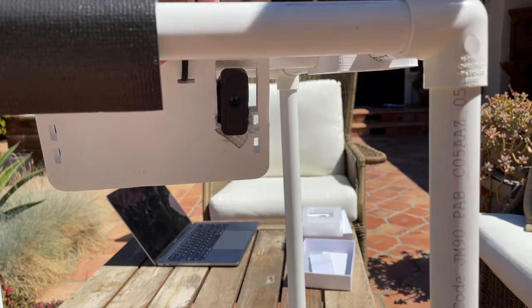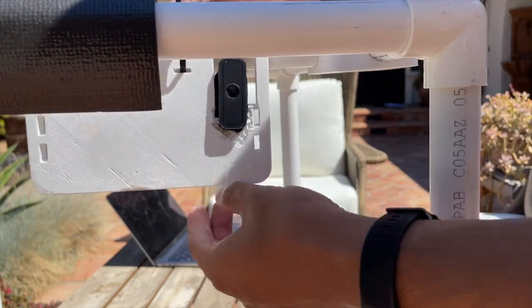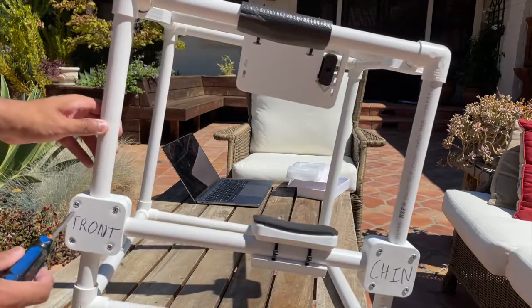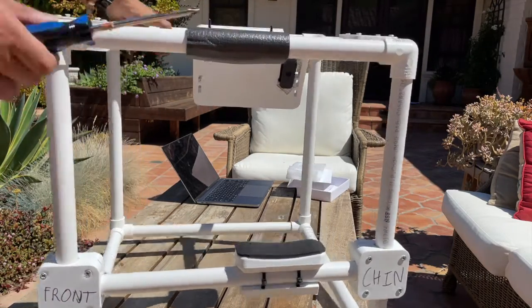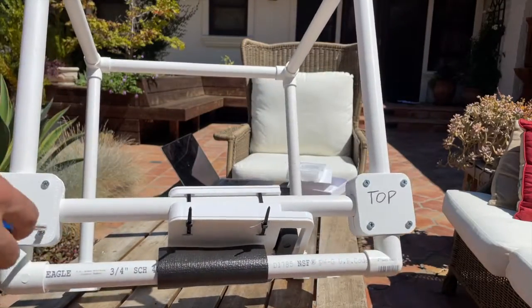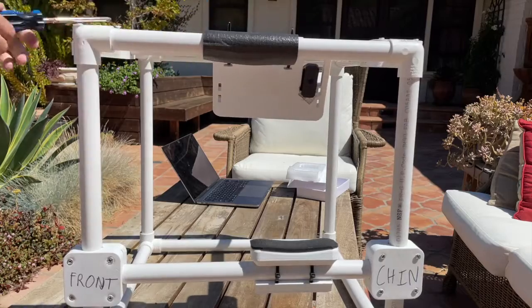We can flip it around and look at the front and make sure the camera is aligned and make sure nothing is obstructing it. And now we see it's good. Now we're going to show you the adjustability of the retinal camera rig. There's 4 points of movement and there's 2 slide bars. To move those, you're going to have to unscrew the screws a little bit so they're loose. And I already have them unscrewed.